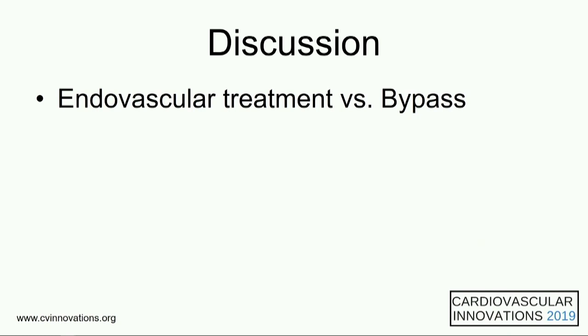In that case, depending how long the patient would have been on the table, I would have tried a retrograde approach. We had 3-vessel runoff. The lesion looked very favorable from a retrograde approach. This is a case that I probably would use the crosser. Very easy to use, usually stays within the lumen. Obviously, the goal here for me would have been to try to stay within the vessel the entire time. As you guys saw, it was calcified. Maybe use some atherectomy there. But in hindsight, hindsight is always 20/20.